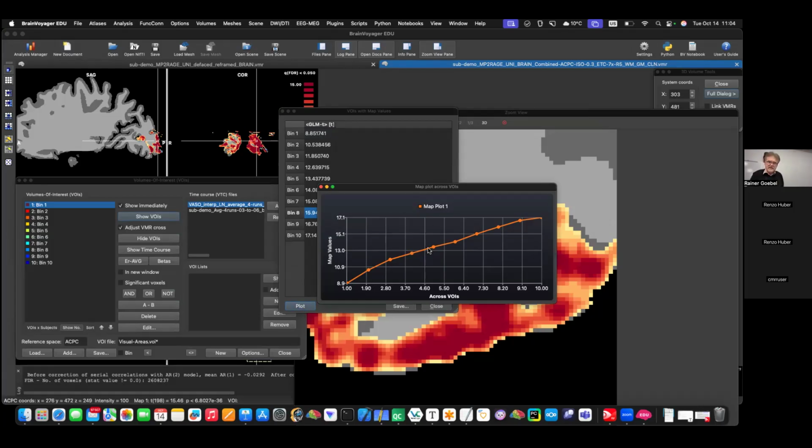in the middle. I don't see that honestly, but you see in this box, you can use others, you can try other areas. This is just one randomly selected one, right? But you see at least you get the typical draining vein effect or whatever that is, right? And if you would compare this and load the other one, which was like this, you would see the difference of bold and Vaso. I plot Vaso exactly in the same way in that space, and then you can compare it. And you can add the T-map for Vaso and bold and get a plot of, you would see then 2 graphs. I can add because at the moment this is sampling the value of the map. So in this case would be the T-stat. Yes, correct. Correct.